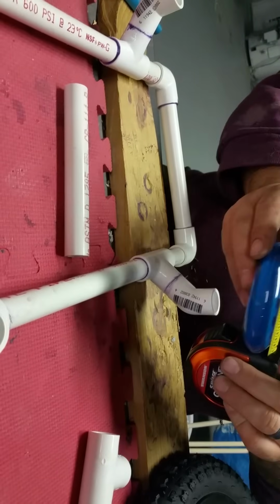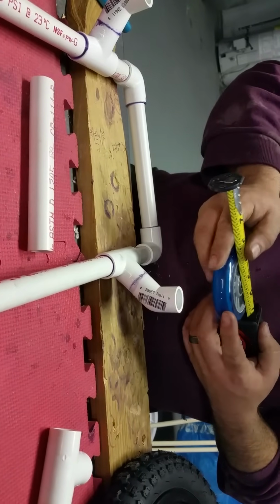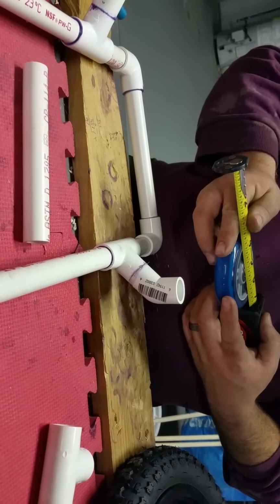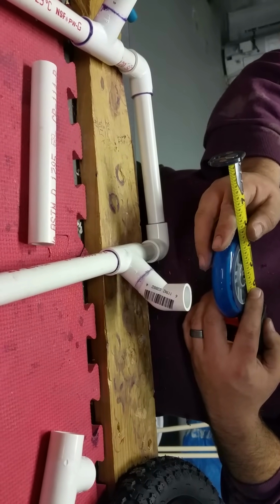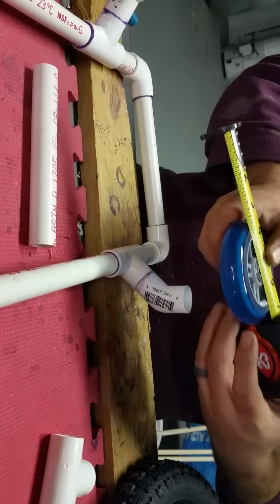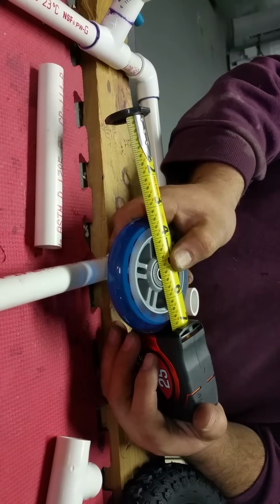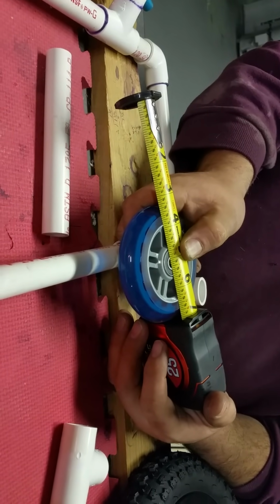Okay, this is a little sidebar. If you were doing, say, a dachshund cart, which most of them are about 7 inches tall, you wouldn't need a back support bar, because the leg length going to the wheel is very short. So you can just go straight down to the wheel.